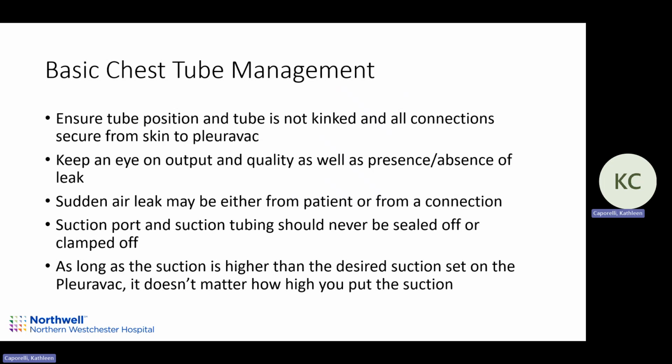So those are just my general takes on how I manage chest tubes. Whenever I'm evaluating a patient in the morning, I always want to see from the tube going in site all the way down to the Pleurovac and to the wall, whether it's on suction. I want to make sure the tube's not kinked at all. I'll have them lift their gown up, take a look, and follow it through. Sometimes they're lying on it, sometimes it's kinked and they don't even realize it. So I always make sure it's not kinked all the way through.